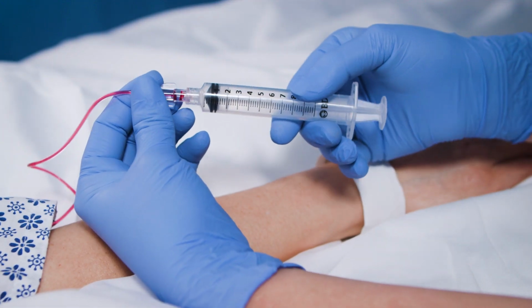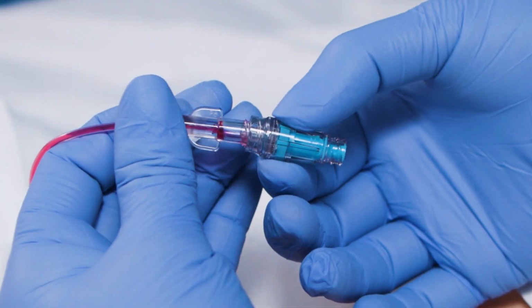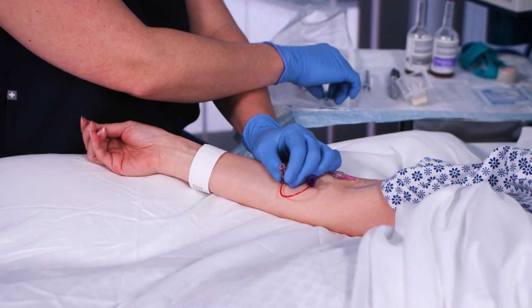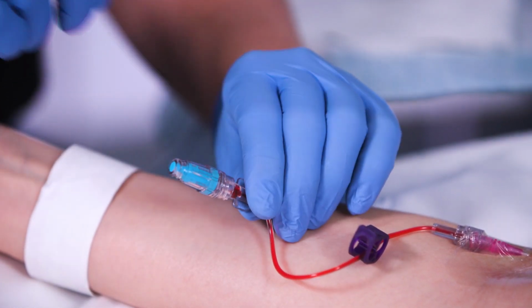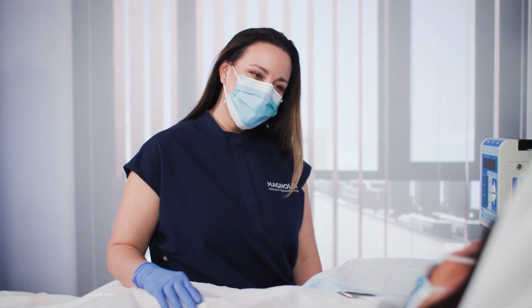If required, attach syringe to collect additional specimens for blood work. Immediately attach needleless connector and flush line per institution policy. If additional specimens are not required, immediately attach needleless connector and flush line per institution policy. Lastly, dispose of supplies according to institution policy.